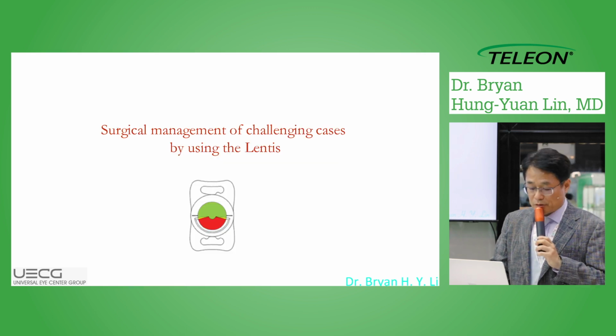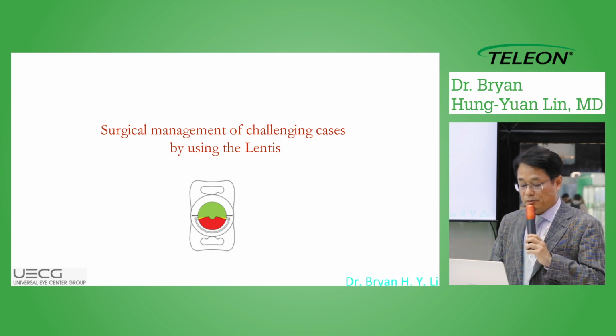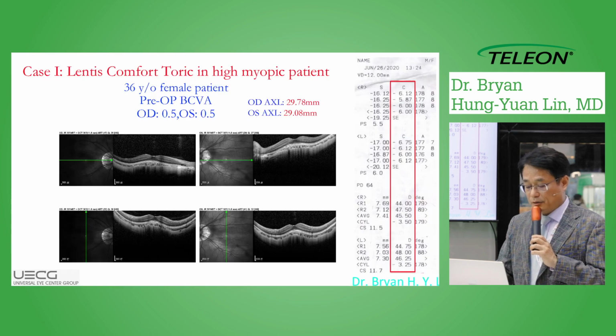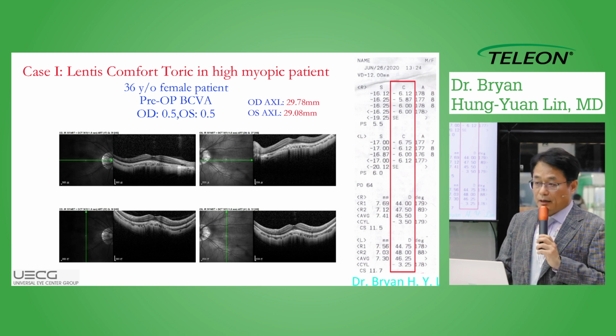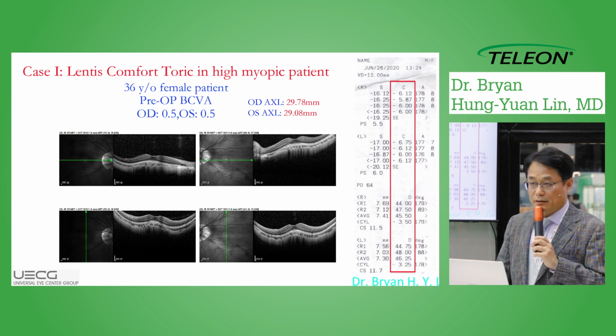Next, I will show the surgical management of challenging cases by using the LENTIS IOL. The first case involves using the LENTIS Comfort toric IOL in a patient with high myopia and high astigmatism. Considering high myopic retinopathy, we recommend this patient use LENTIS Comfort.